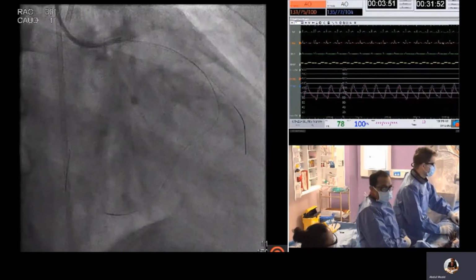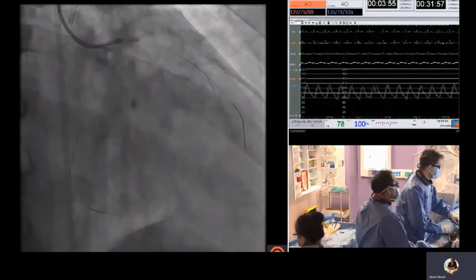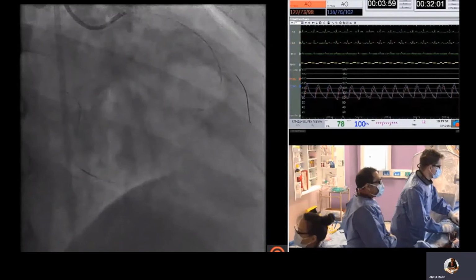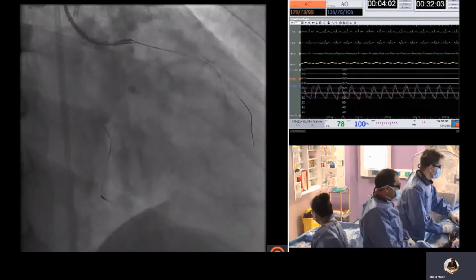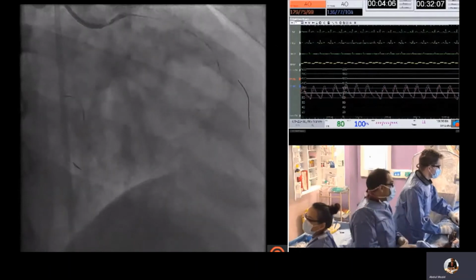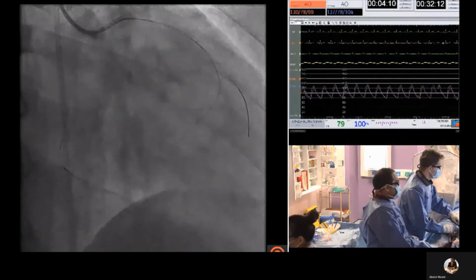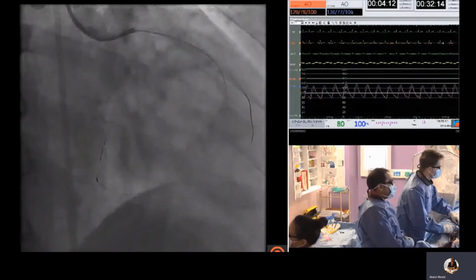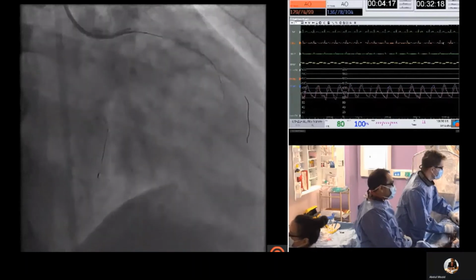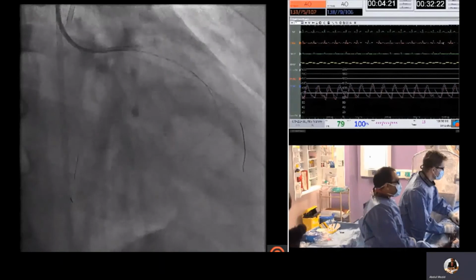So this is a good teaching point in that even if you do not see clear septal communications by angiogram, it is always worth pursuing these and trying septal surfing rather than attempting a high-risk epicardial. So this is really reassuring that we've now managed to cross retrograde via septal. The Turnpike LP is now advanced up to the mid-RCA towards the distal cap of the occlusion.